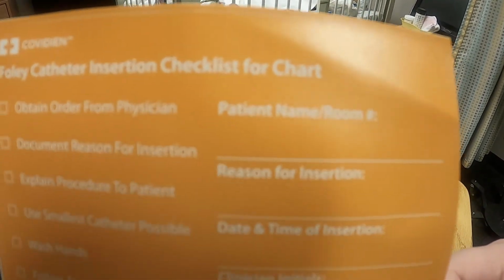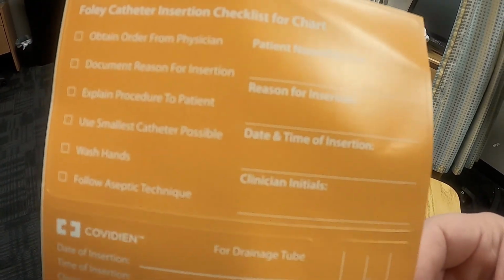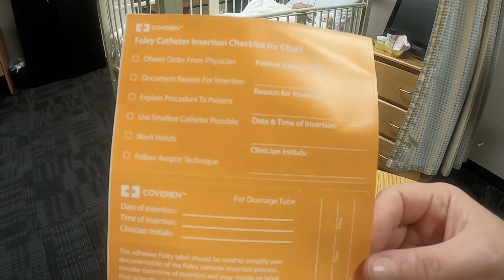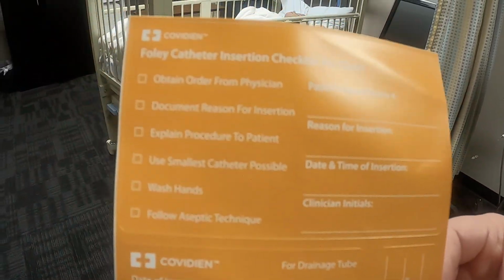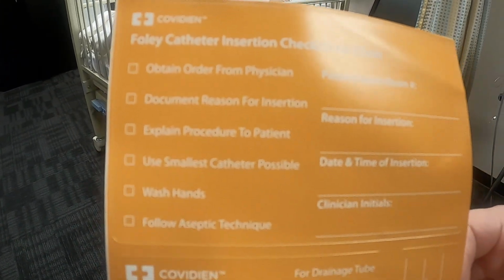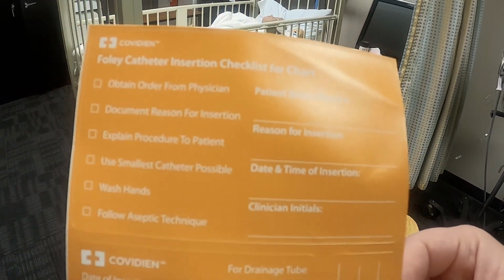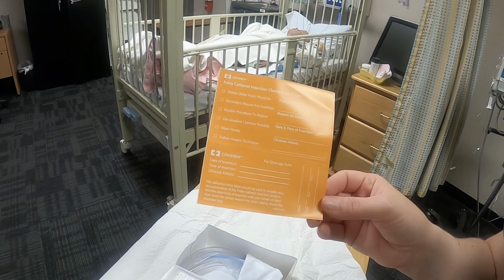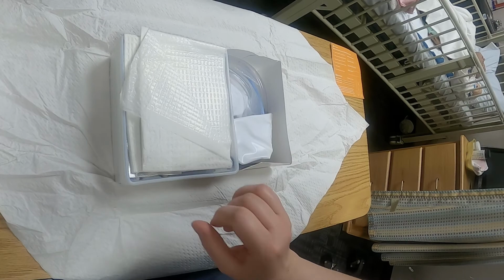It reads the name or room number, why we inserted the Foley catheter, the date and the time of the insertion, as well as the clinician's initial. Okay, it also has a little check mark that you need in order to insert the Foley. Reason, procedure was explained to the patient, the smallest catheter possible, that you need to wash your hands, as well as maintain aseptic technique. Of course, the Foley needs to be a sterile procedure, right? Okay, so we'll move this over here. That way we have it ready.